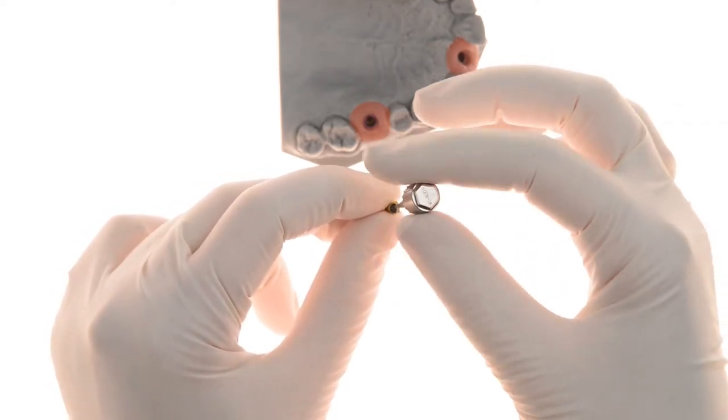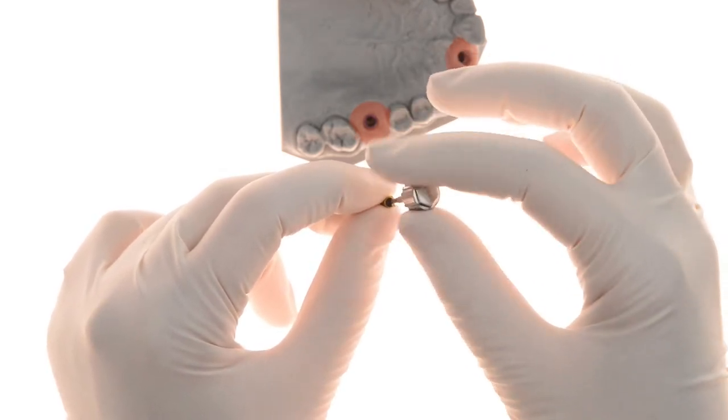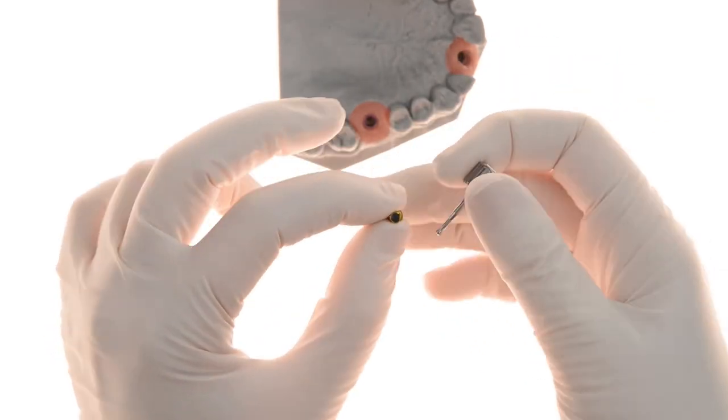Then the monoblock restoration is cemented to the abutment. Finally, the EasyBase restoration is screwed and tightened to the implant.